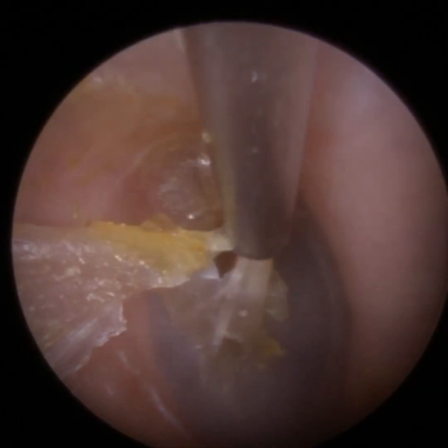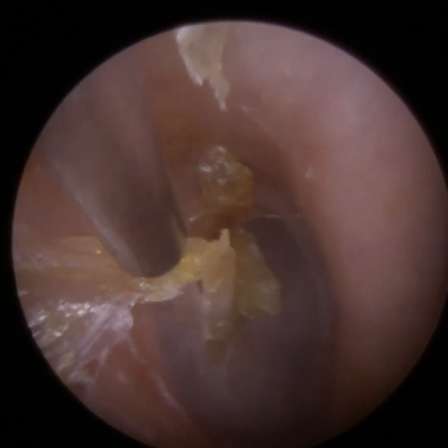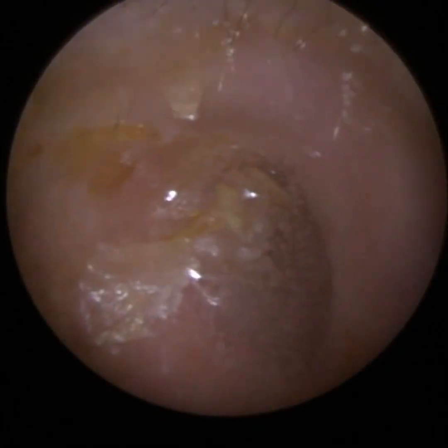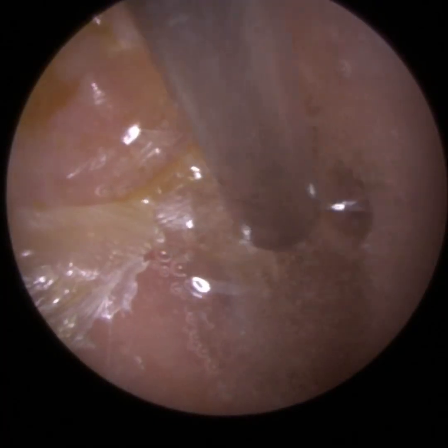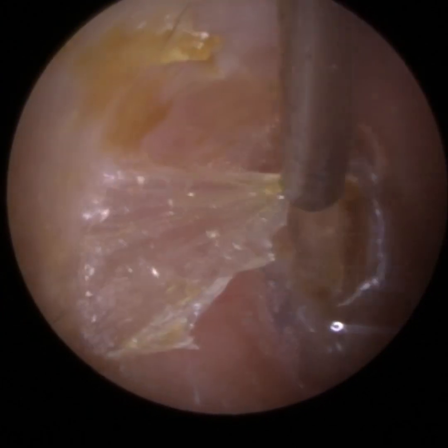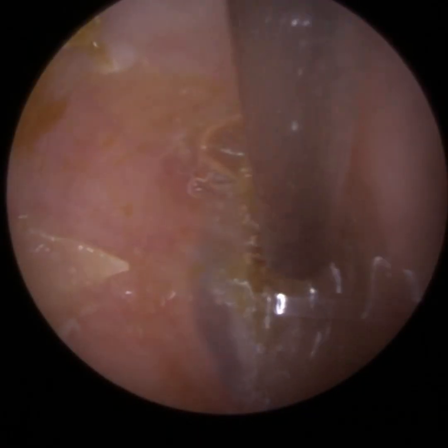So it can be really tricky removing the skin, and it can be quite noisy as well. You get a bit of clarinetting, hence why I'm using a fine end. The patient did move on a couple of occasions, so as I was trying to peel the skin off, I was half preparing myself to move out of the ear just in case he does move. And you'll see a moment a bit later on where there was a sudden movement, and I had to quickly evacuate the ear to prevent any trauma.